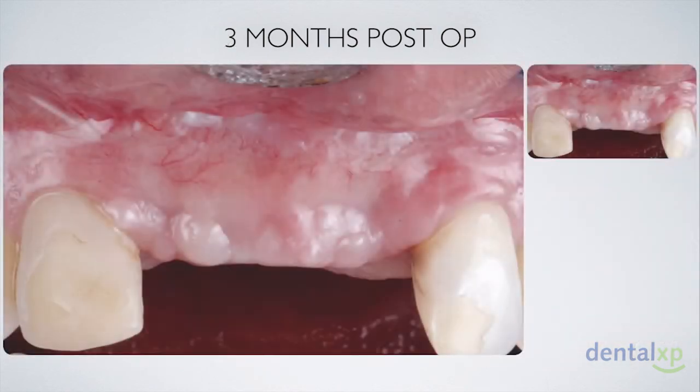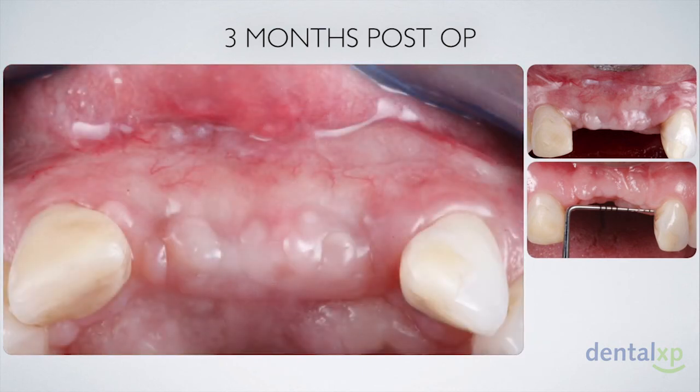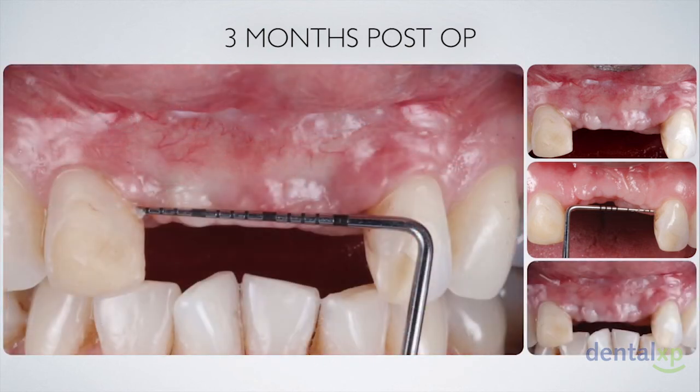So looking at our treatment, we were able to improve not only the lost tissue volume of this site in both horizontal and vertical dimensions, but greatly improve also the tissue quality, which is essential for maintaining health and function around these future restorations around those implants.